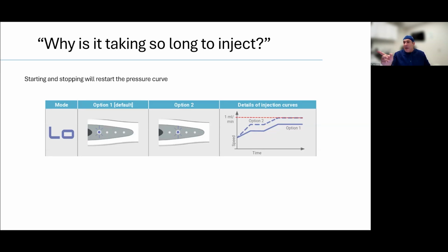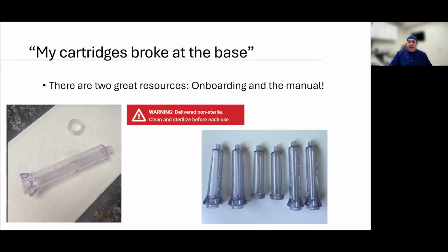Again, excuse me, I said drive, you're in cruise, correct? In cruise, Chris and Jordan and Eric? Correct. So if you're in cruise, you're just going to keep your foot down and it'll continuously deliver your local anesthetic till you come off the pedal. But if you're doing on, off, remember you're starting that curve, and it's going to slow you down.